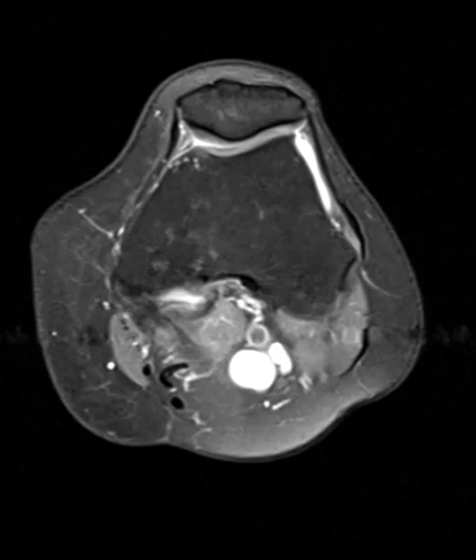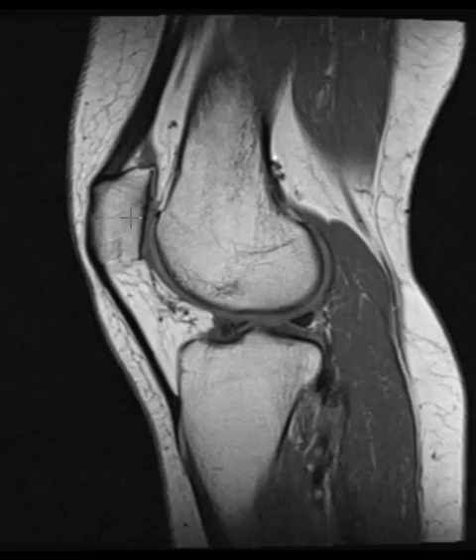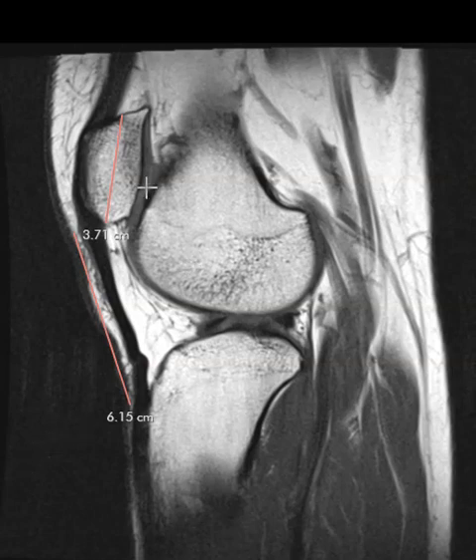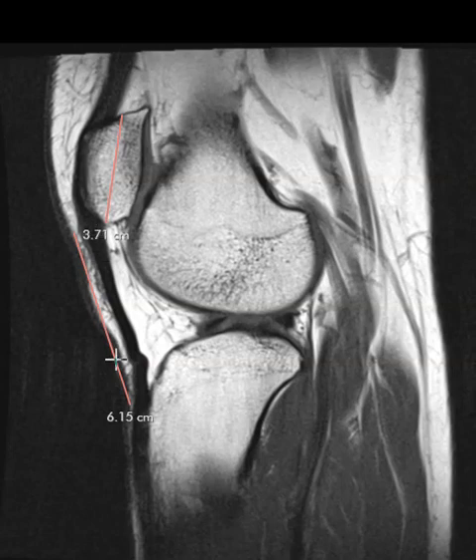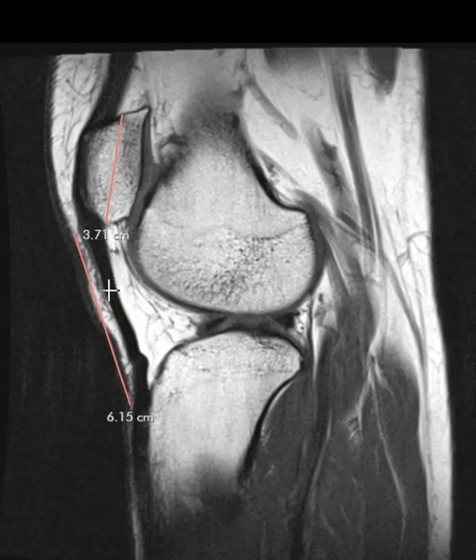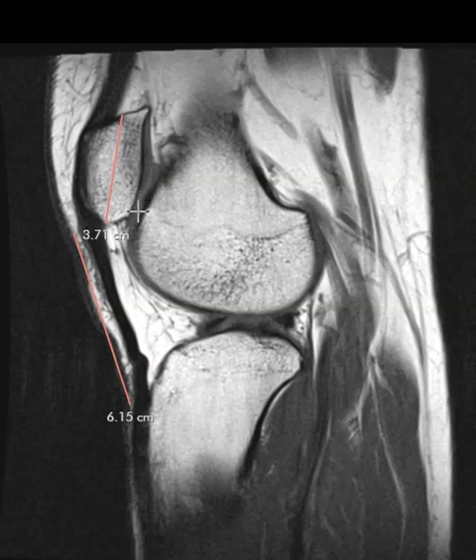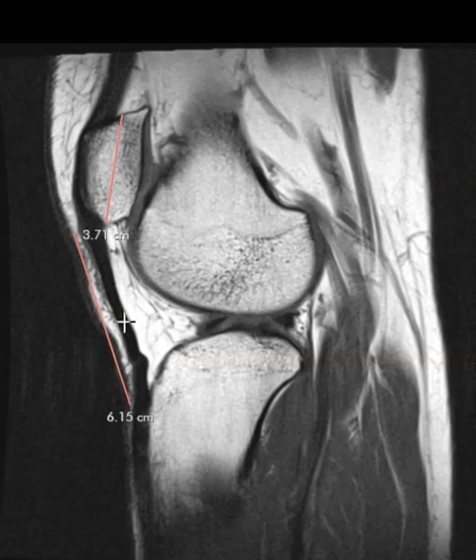Now we're going to go on to the other patient. Again note the middle of the patella here and its relationship to the femur. On this patient we can see that the kneecap is 3.7 centimeters in height and the patellar tendon is more than 1.5 times the height — so this is abnormally long and the kneecap is high. The epicenter is right here and it should be down about here. We have a high riding patella. We call this patella alta, related to this elongated patellar tendon.